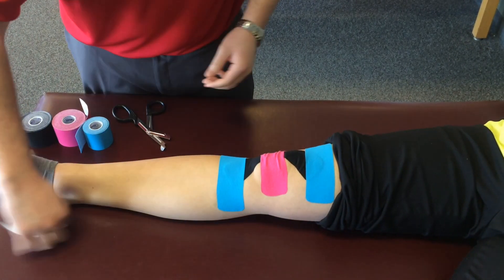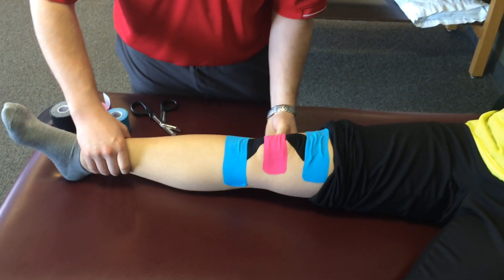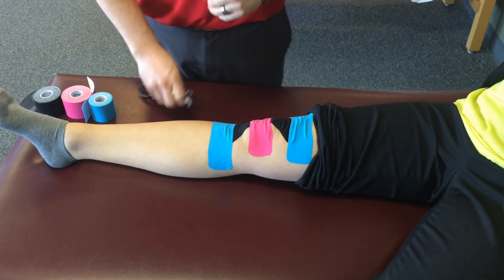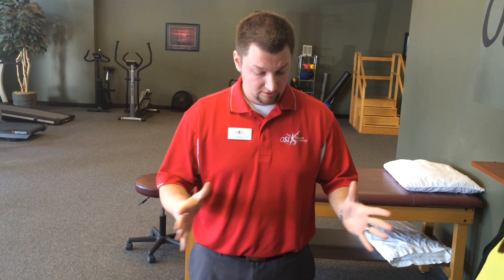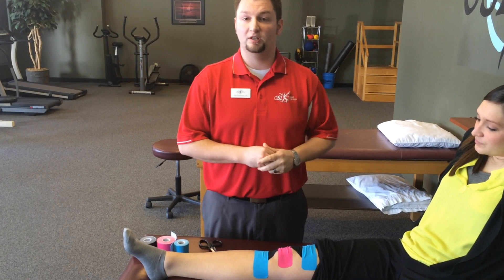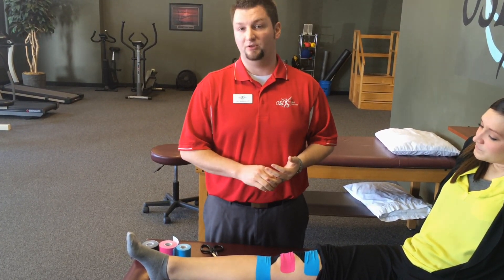I'll get my scraps out of the way one last time. I'll check to ensure that her knee moves well passively — that's me moving it. And then what we'll do before we send her home is make sure that she can squat, run, jog, and move her knee on her own without the tape pulling uncomfortably or coming undone. That's a very basic taping technique. There are probably hundreds of different ways to kinesiotape the knee — this is just one thing that we might do in the clinic for somebody in the active athlete population.